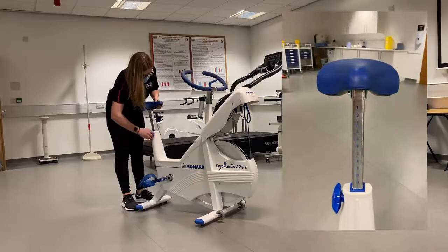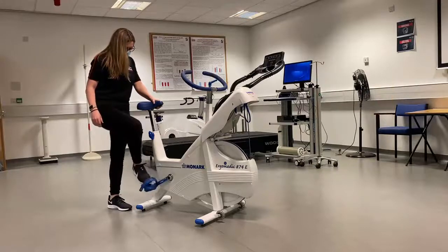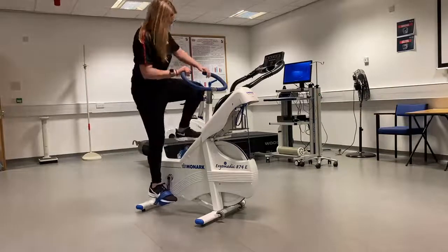On the saddle post each height option is numbered for ease. This is also handy if you'll be testing the same person repeatedly, as you can note the number down to replicate settings.